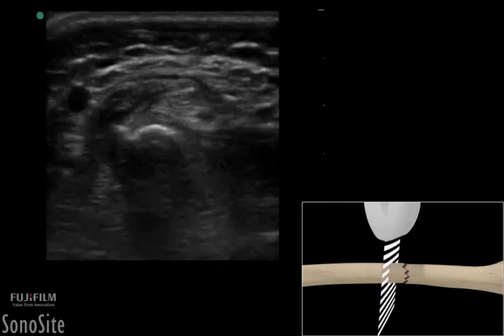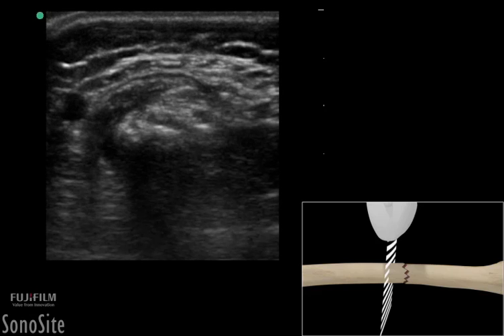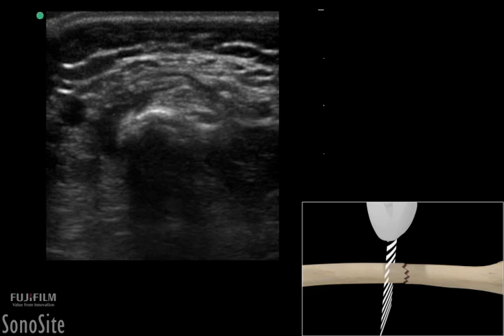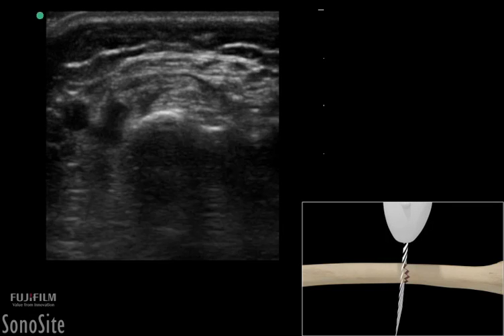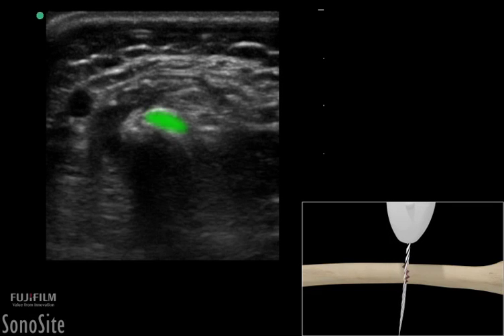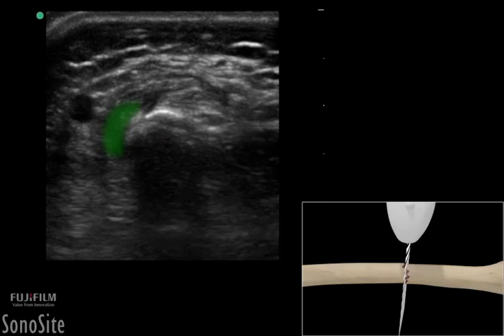The transducer should then be rotated 90 degrees counterclockwise with the orientation marker directed toward the patient's right side. The transducer is slowly translated down the injured extremity. The fracture will appear as an isolated, hypoechoic region in the hyperechoic bony cortex with an accompanying fracture hematoma.